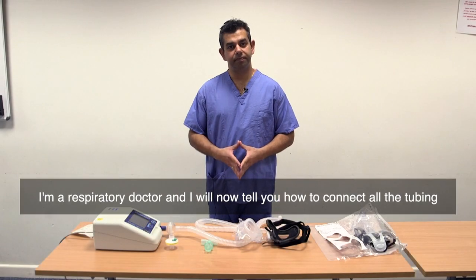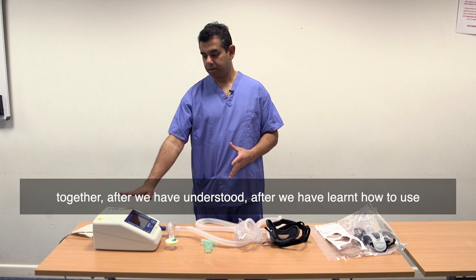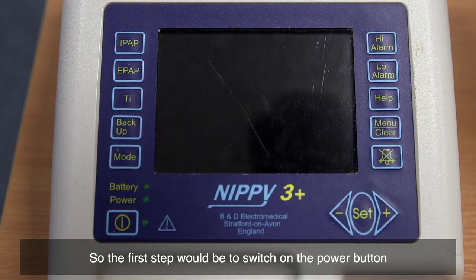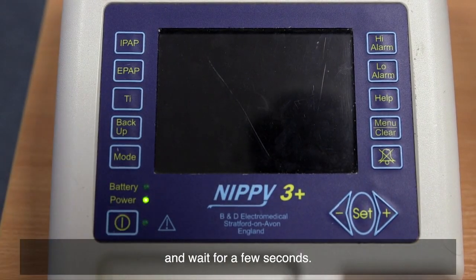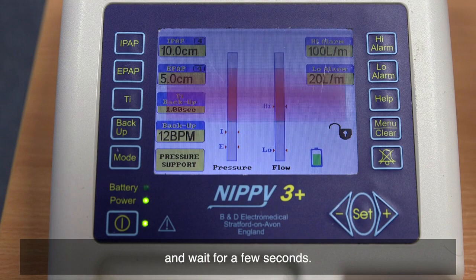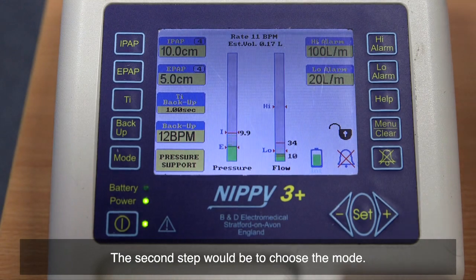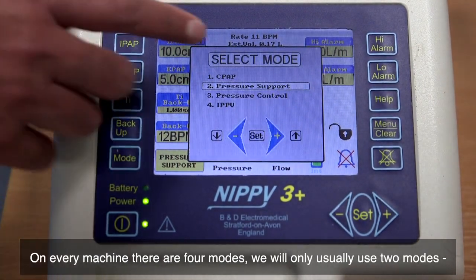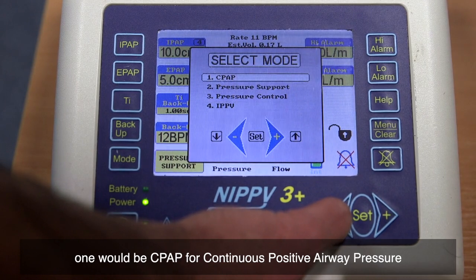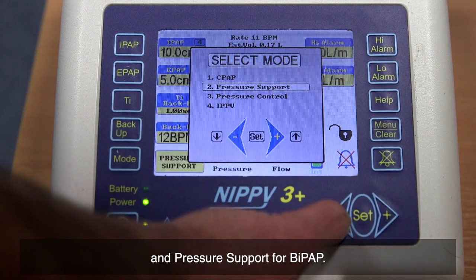I'm a respiratory doctor and I will now tell you how to connect all the tubing together, after we have learned how to use the machine as well as put up the mask. The first step would be to switch on the power button and wait for a few seconds. The second step would be to choose the mode. On every machine there are four modes; we will only usually use two — one would be CPAP for continuous positive airway pressure, and pressure support for BiPAP.